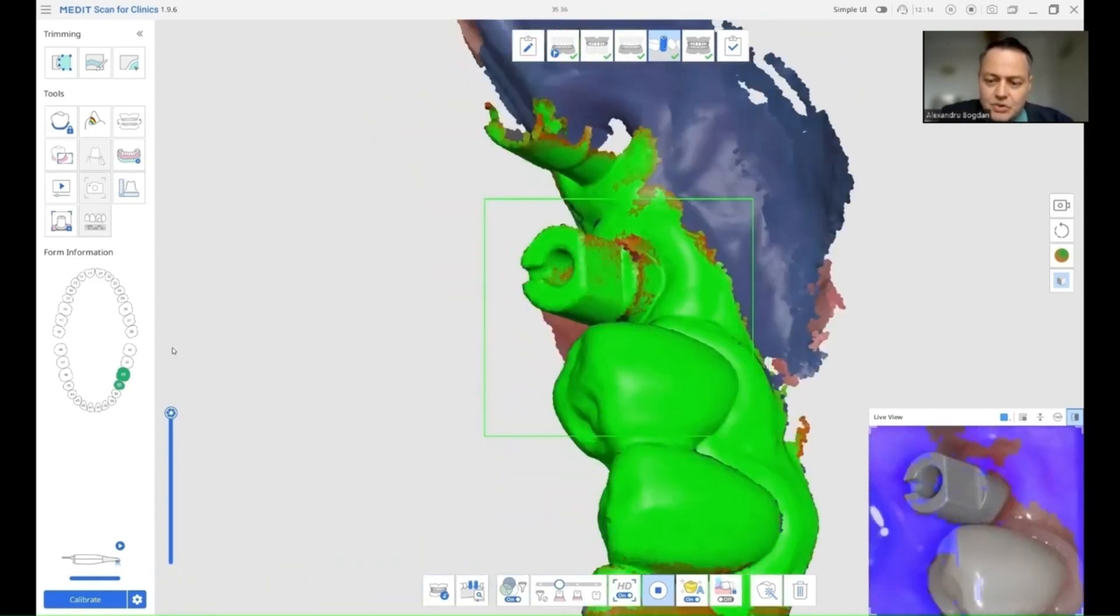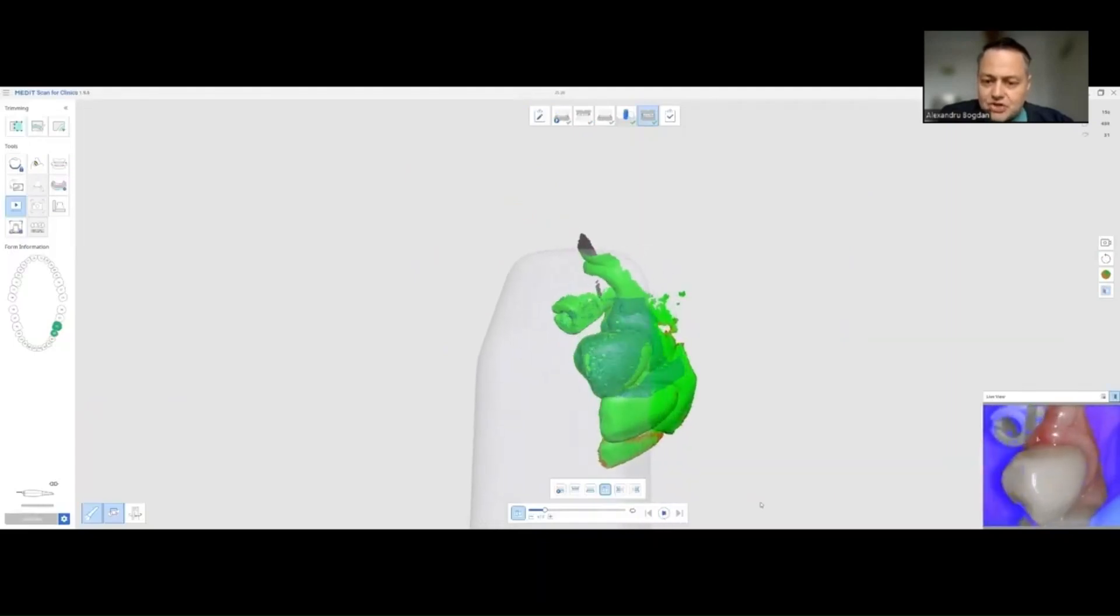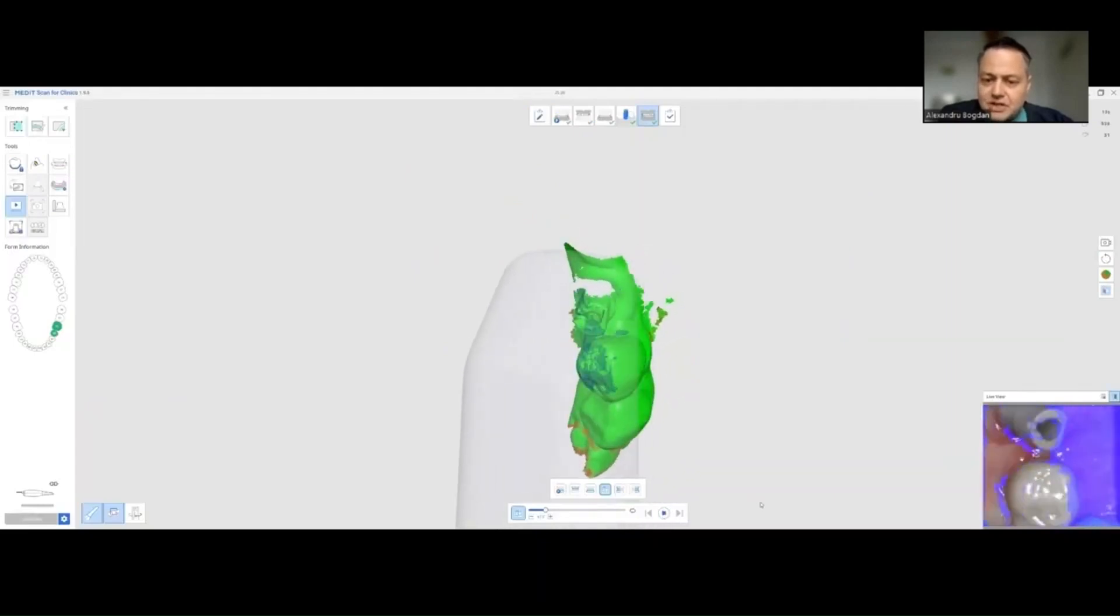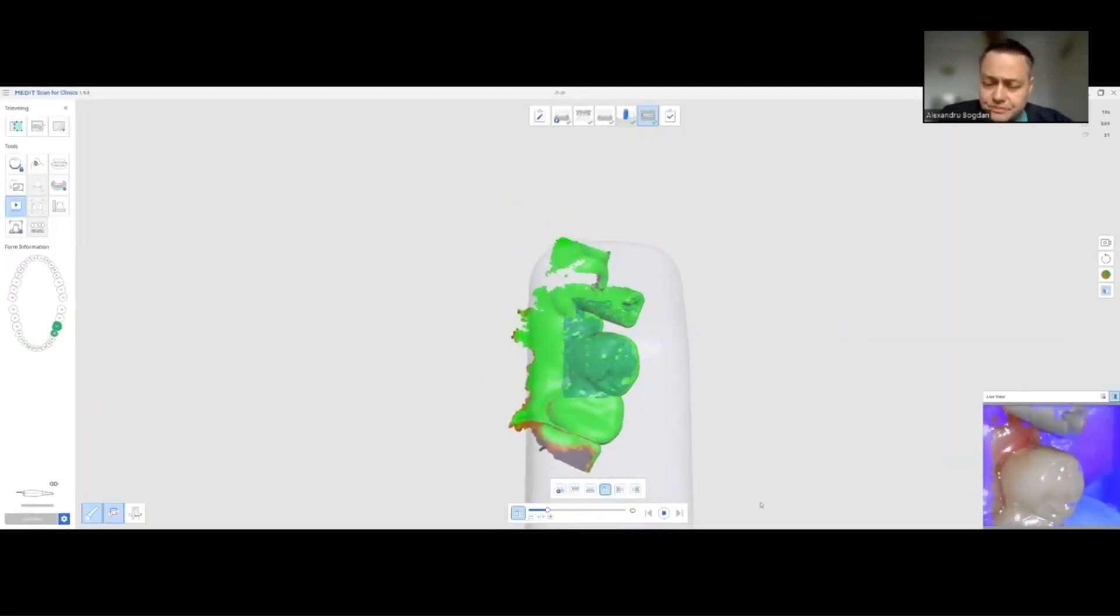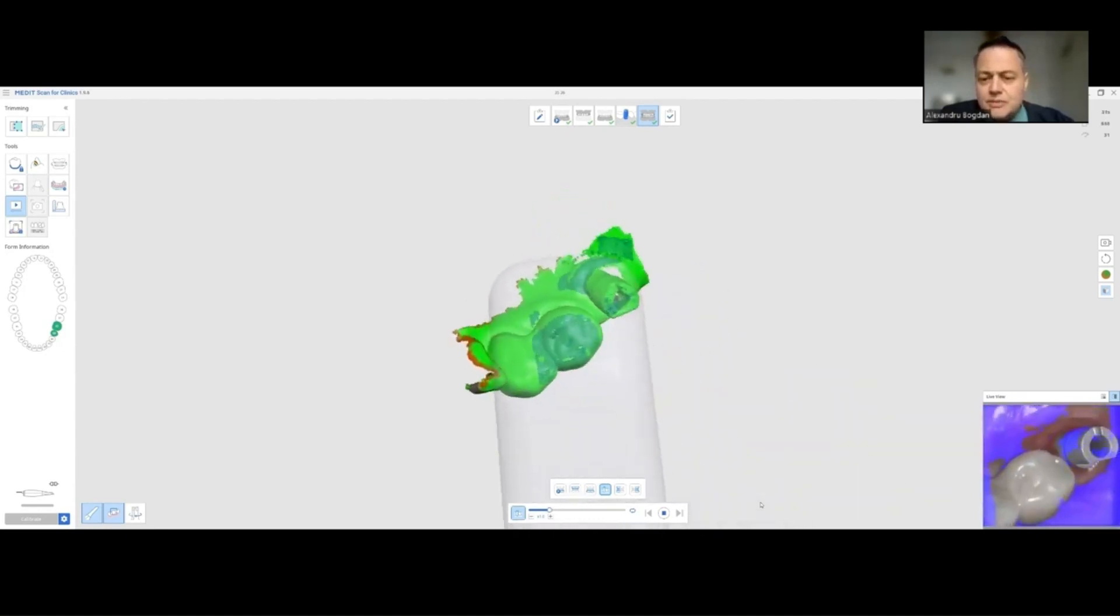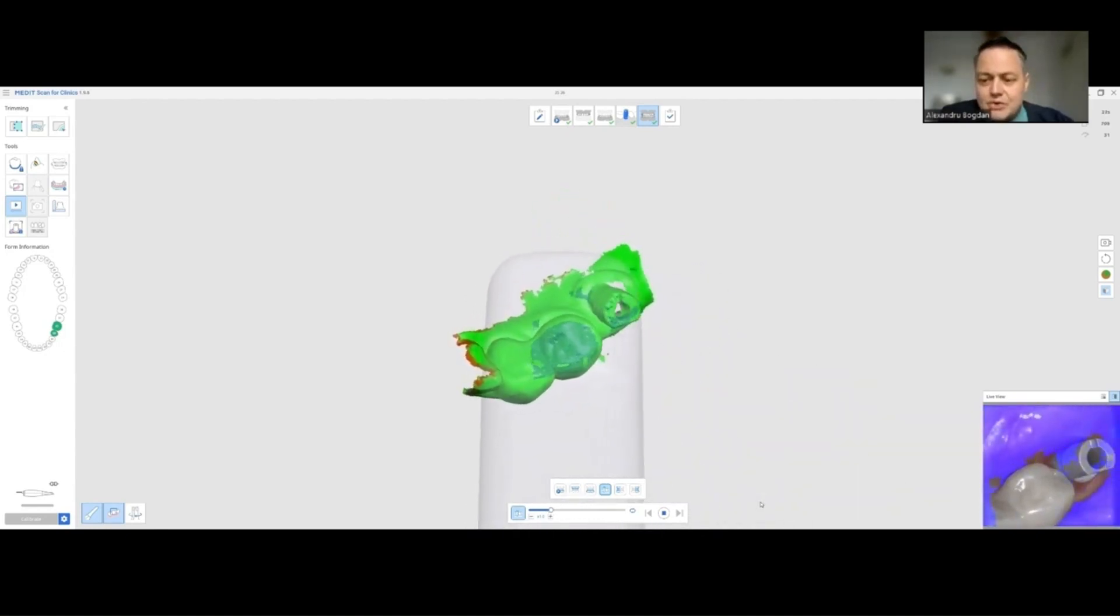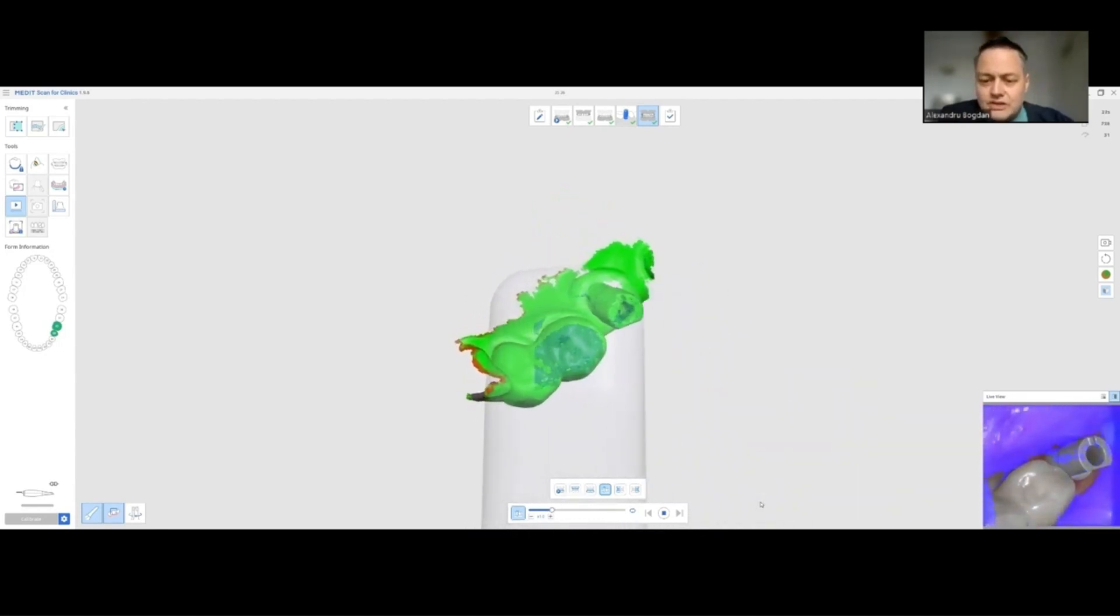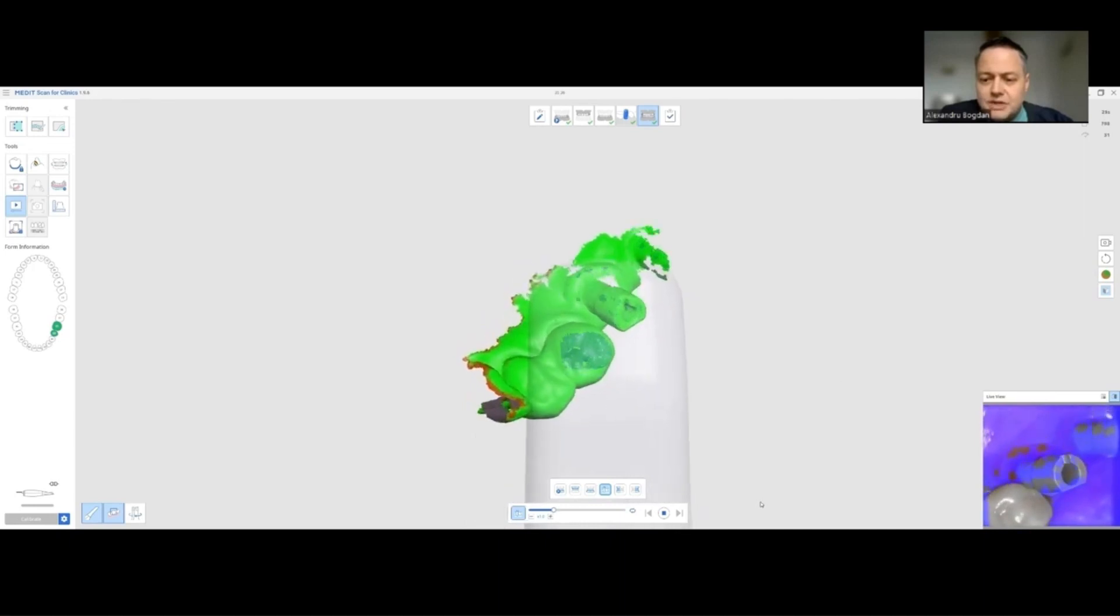Now, I'm going to start and image the scan bodies after I optimized the image that I did before. What I want you to see here, I am trying to image the scan bodies, never losing contact with the mesial teeth.